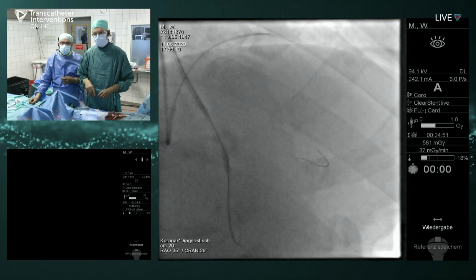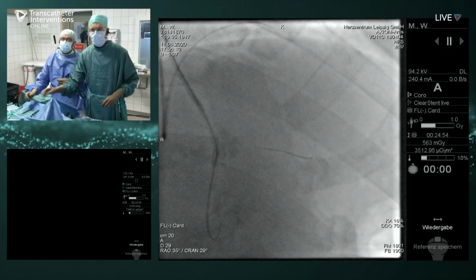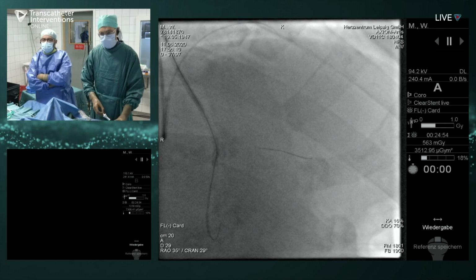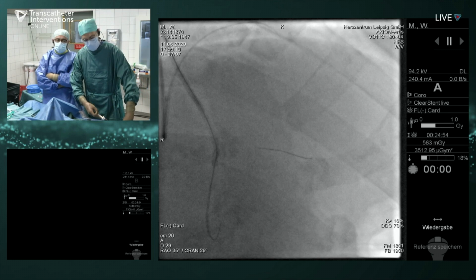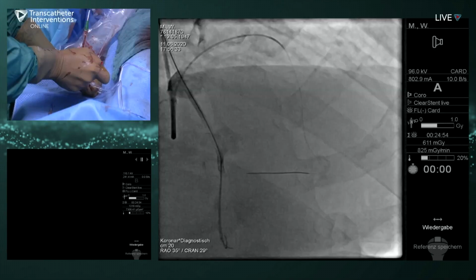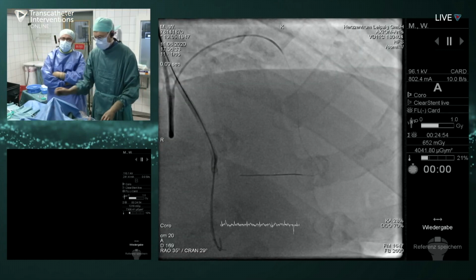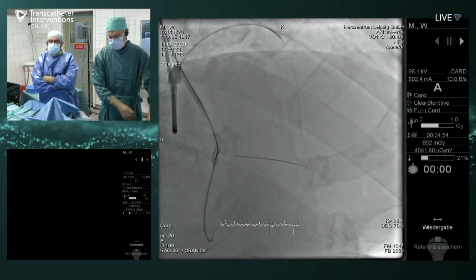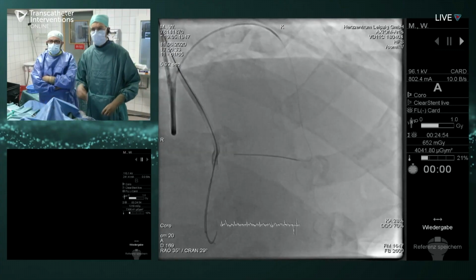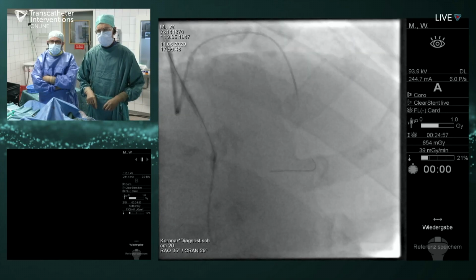That's too high. Let's see where we are. It seems high, but maybe with an angio you'll see. Yeah, it's too high. Very occasionally you get little branches like that that go to the RPLV. Ajay, am I a little bit old-fashioned, or is there anybody who starts with the regular cyan wire? I do the deed. Okay.